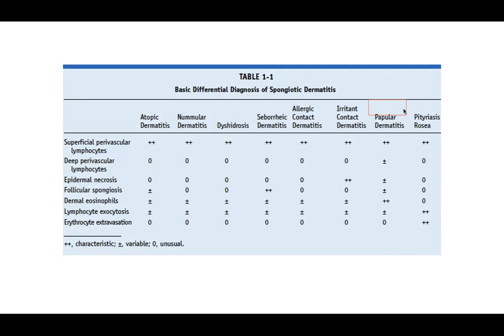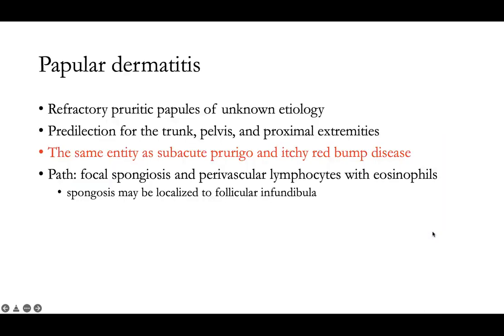Bonus information is that pityriasis rosea is usually associated with HHV-6 or 7, it's thought. But at the end of the day, it's a pretty classic clinical presentation, but the dermatopathology is somewhat subtle. So you're looking for mounds of parakeratosis with not a lot of neutrophils, or else you'd be thinking about a guttate psoriasis. You're looking for some mild spongiosis and maybe some foci of extravasated erythrocytes.